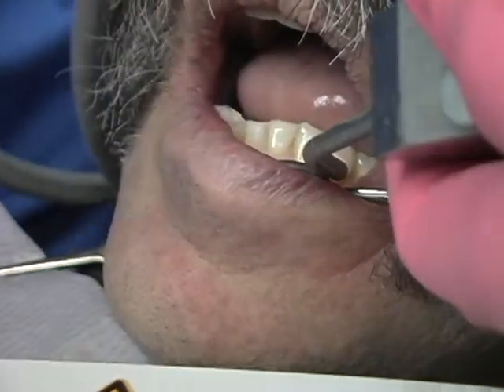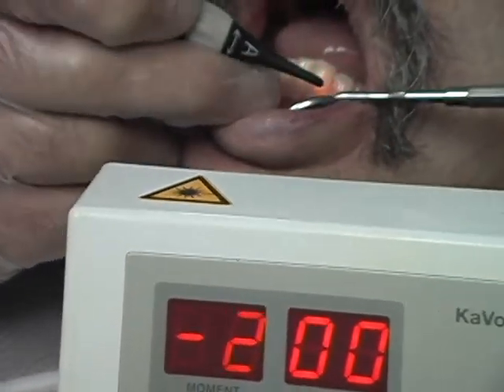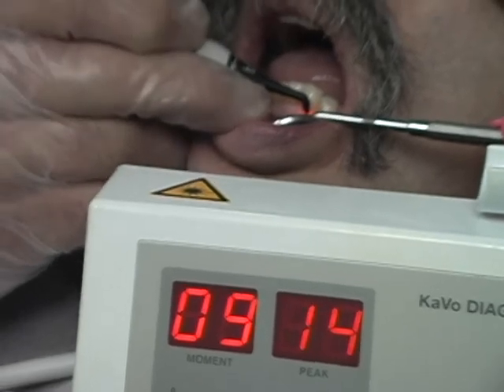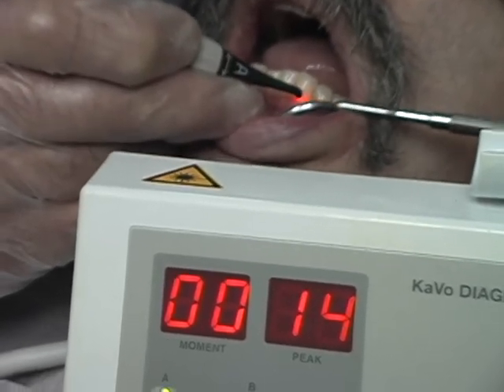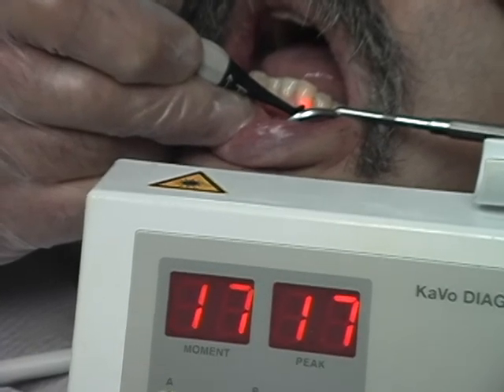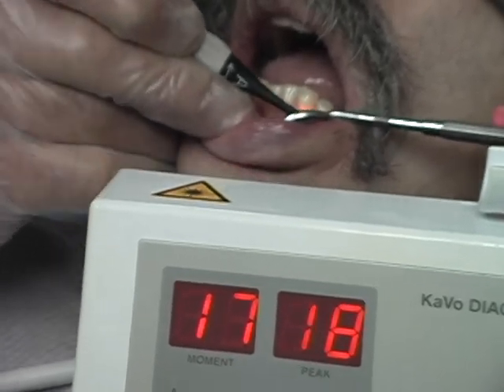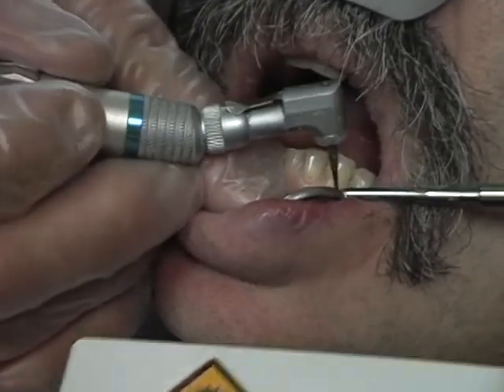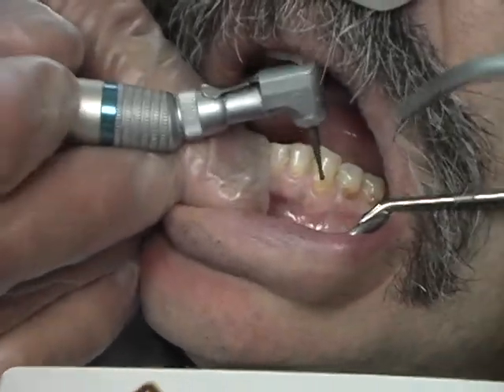Now we're going to rinse that a little and we're coming back with the Diagnodent to see we're still getting a little decay — a few areas that are soft — but the numbers are getting better and better. We're getting down to 17, but 18 I consider is still very soft and there's not enough mineral content to get a good adhesive bond.